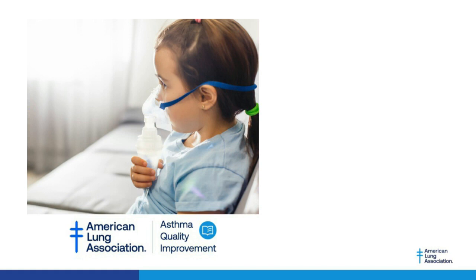This is something that our own healthcare systems and also our infection prevention and our pulmonologist, including my medical director, have all suggested that it should be included, and so we included it as an aerosol generating procedure at our own site. And I have had that debate with some of my outside medical directors and pulmonary lab medical directors that have said, show me where it's listed in the CDC. Well, I don't think I have to show you. We know that spirometry is a forceful maneuver, and we know that it generates cough. We know that cough and forceful maneuvers aerosolize particulates. And so to me, it's sort of a no-brainer, even though the CDC, I think it was an oversight, did not list it.